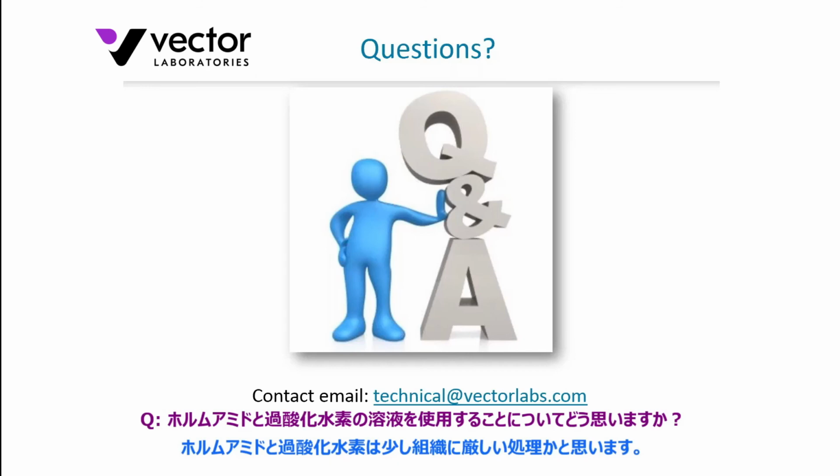That sounds a little harsh, particularly for a whole mount. Some of these whole mounts of xenograft or zebrafish embryos you might be working on are quite thick, and you want to take a more gentle approach. So just be careful with the use of some of those harsher reagents on those preparations.